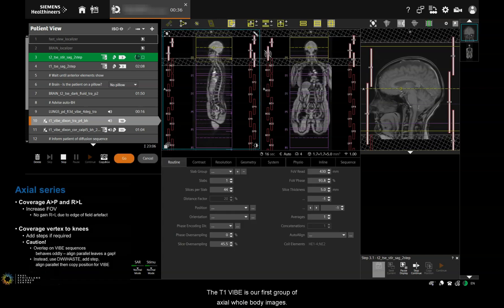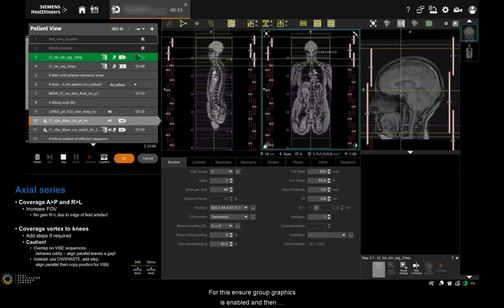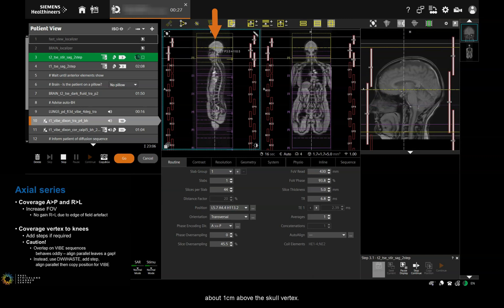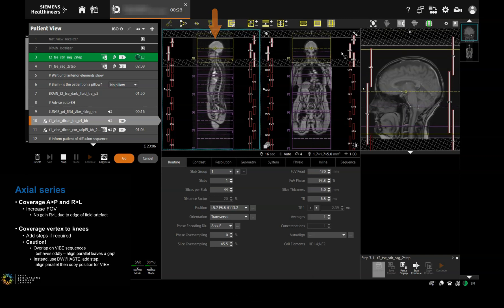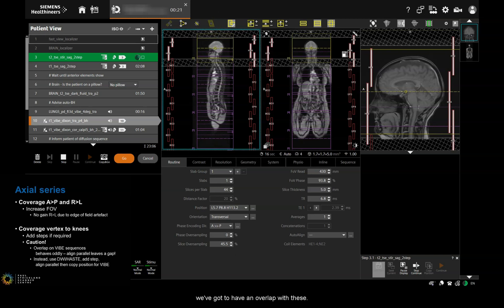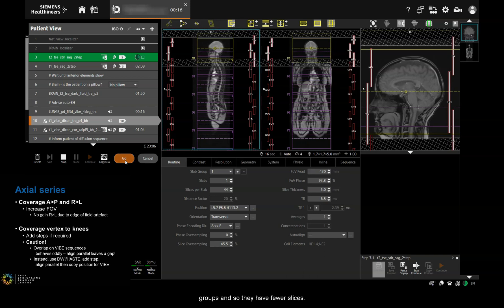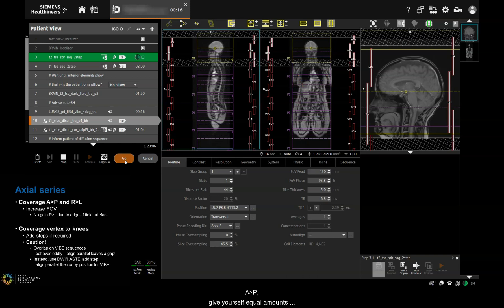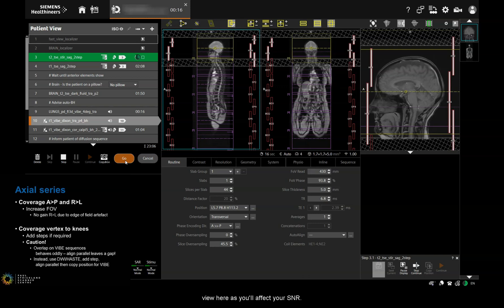The T1 VIBE is our first group of axial whole body images. Ensure group graphics is enabled, then position the slice group so that the first slice will be about a centimetre above the skull vertex. VIBEs are tricky to get to compose, so we've got to have an overlap — this overlap isn't required for the later diffusion slice groups, so they have fewer slices. If you're not high enough here, you might miss the first slice of the skull on the diffusion. For right-left coverage, the humeral heads are a good landmark — make sure they are equidistant from the edges of the slice group. AP, give yourself equal amounts of fresh air front and back, and don't be tempted to reduce the phase field of view as you will affect your SNR.